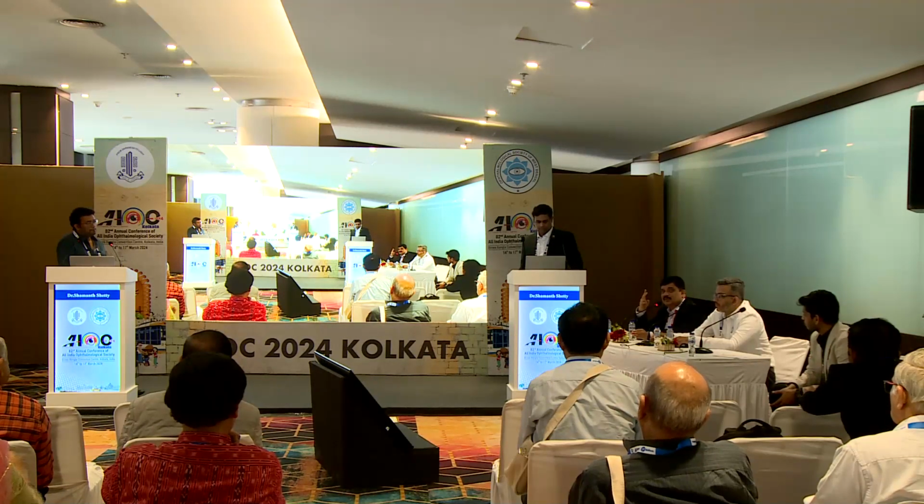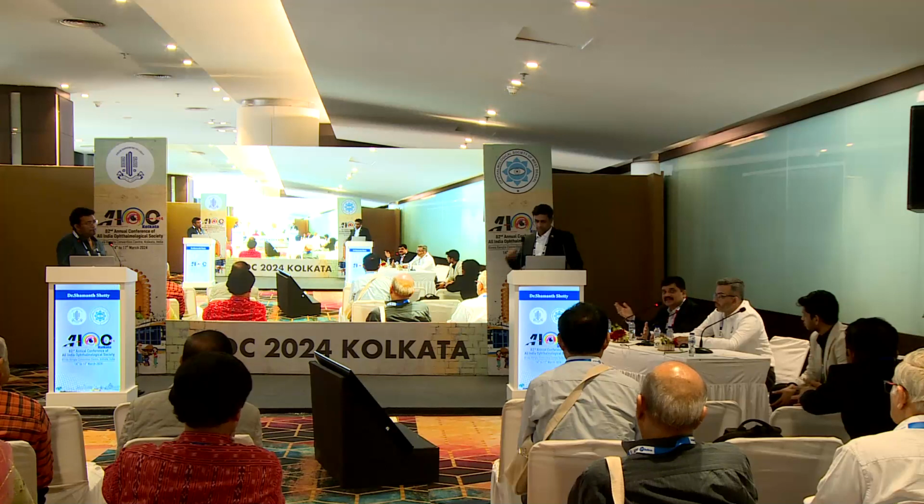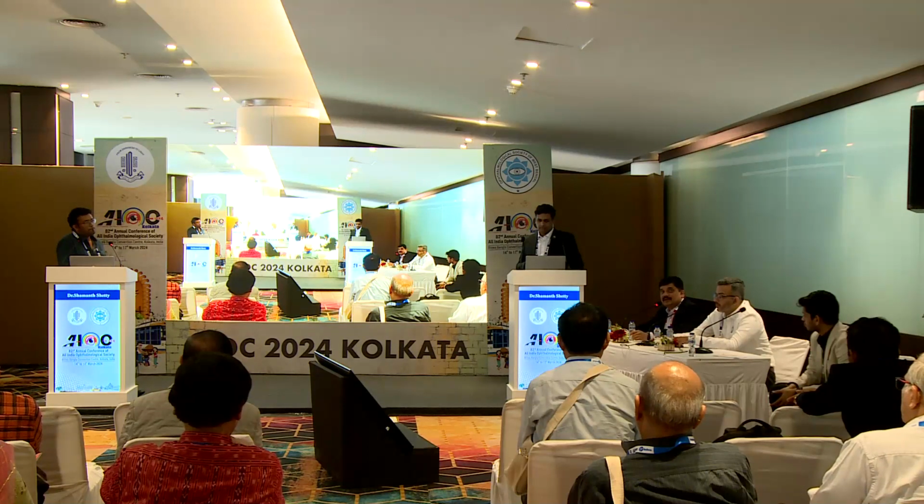There are two possibilities. They might be having a larger capsule bag itself, and also some people might have done it under the block, where once the eye is anesthetized, the Purkinje image may not be that true. These are the 2 points.